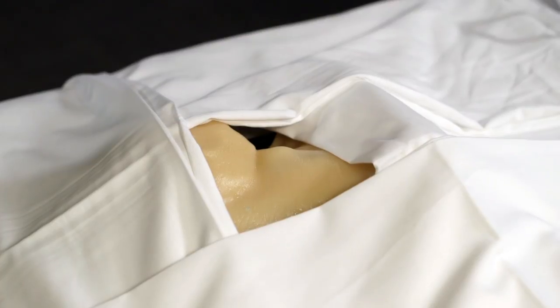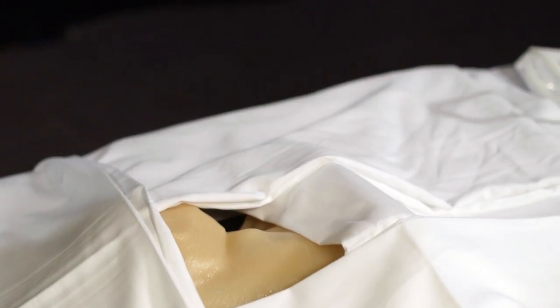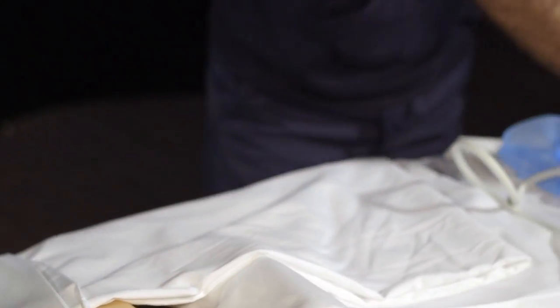Set up for insertion using sterile technique. Put on your sterile gown and gloves and set up your central line kit. Then prep and drape the skin.